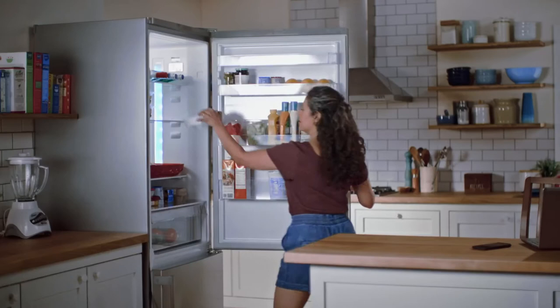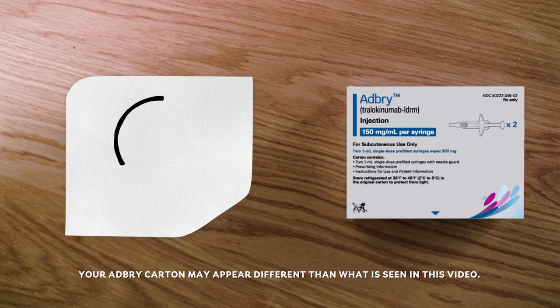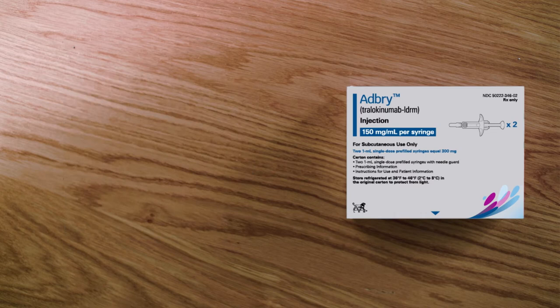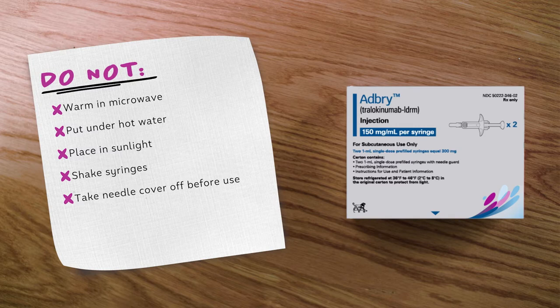Take your ADBRI carton out of the refrigerator and check your carton's expiration date. Don't use it if it's expired or if the seal is broken. Each carton contains two pre-filled syringes. Remember to keep your ADBRI cartons in the refrigerator until you're ready to inject. Never freeze your syringes or use syringes that have been previously frozen. Keep ADBRI and all medicines out of the reach of children. Let your syringes warm up to room temperature by leaving them in the carton on a flat surface away from direct light for 30 minutes. Don't try to speed up this process by warming the syringes in the microwave, under hot water, or in sunlight. It's important you don't shake the syringes, remove the needle cover until you're ready to inject, or put the syringes back in the refrigerator once they've warmed up.